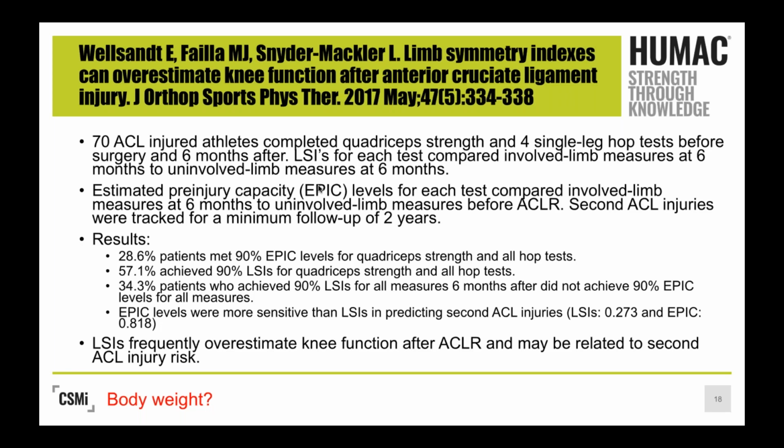But the nice thing is, especially with our American units, as much as I think our American units are bad, the American units line up perfectly on the machine. It's 1 foot-pound of torque for 1 pound of body weight. Whereas if you use the international units, it's a 3-to-1 ratio.